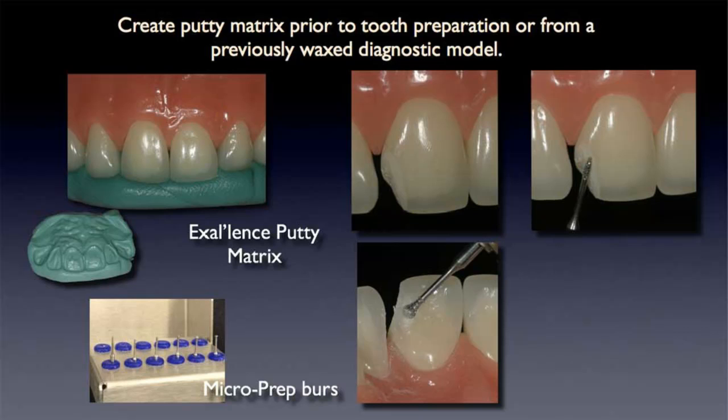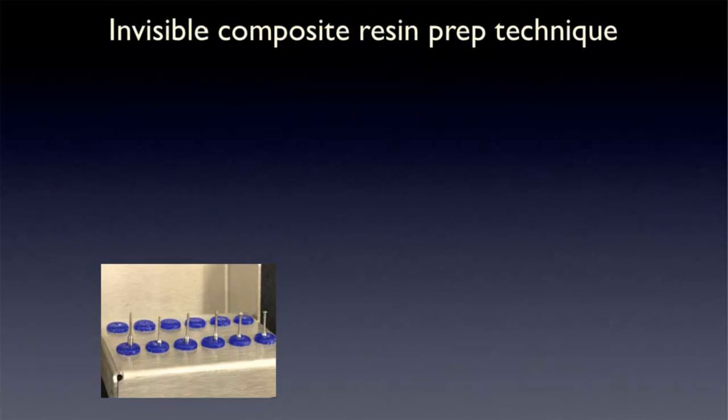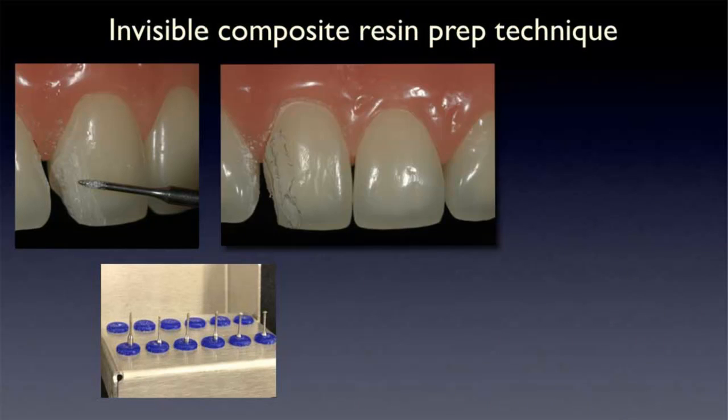The other thing that I do is I scallop my margin so that my margin is irregular. That irregularness doesn't allow light to break in a very linear or straight way, which then creates, again, a natural effect. Some people describe this as a sunburst type of irregularness. I call it just a scalloped irregular type of line you can see right here. Okay, so very important: the double bevel technique as well as scalloping on the second bevel line.